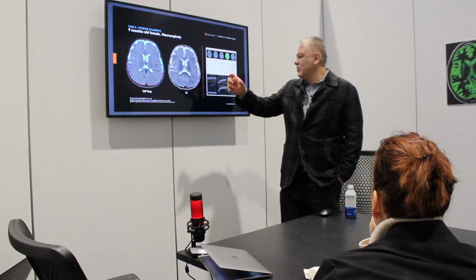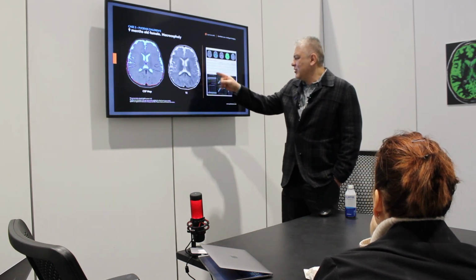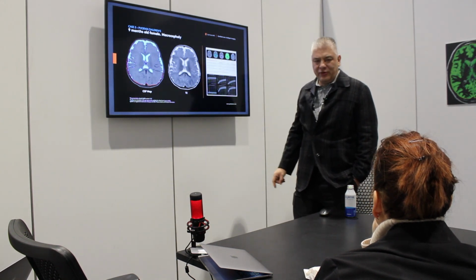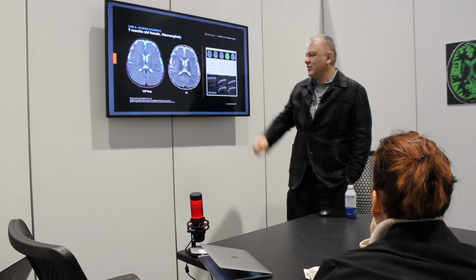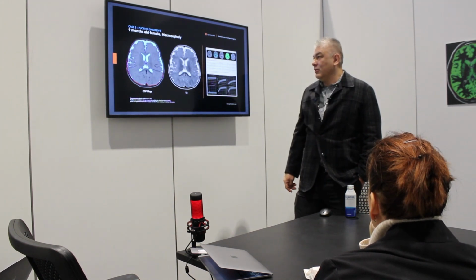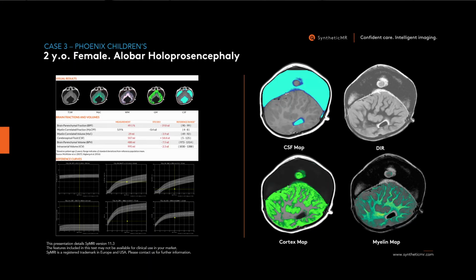It's all based on age. This is based on the patient's age, how much CSF volume this patient should have, and there are 4 standard deviations above. So right away, don't report it as just some benign increment in subarachnoid space, but as a significant increase in CSF to explain the macrocephaly.